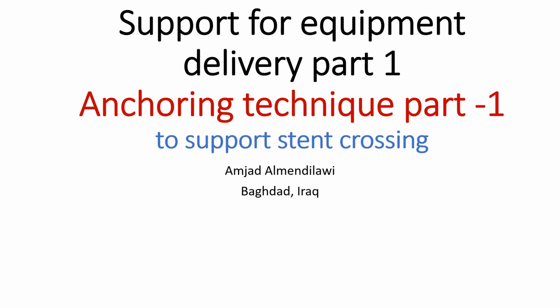Hello, this is Amjad al-Mendilawi from Baghdad, Iraq, delivering a presentation on how to increase support for delivery of equipment during PCI. Part 1 will be about anchoring technique, where two cases are going to be presented.